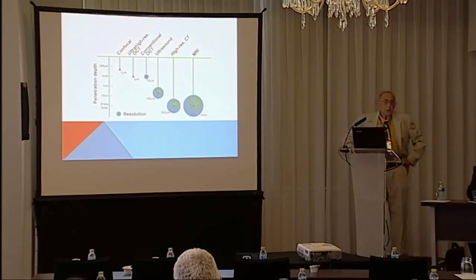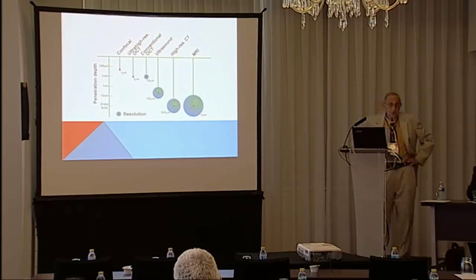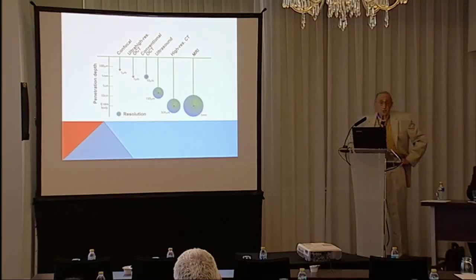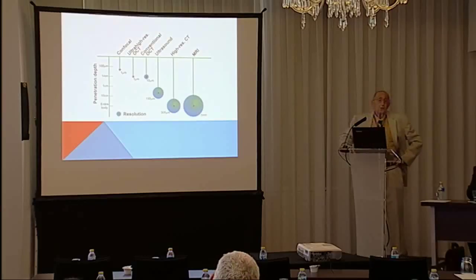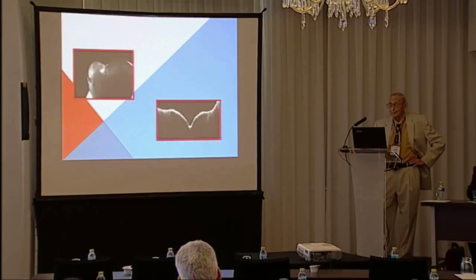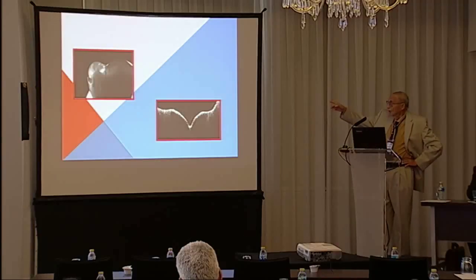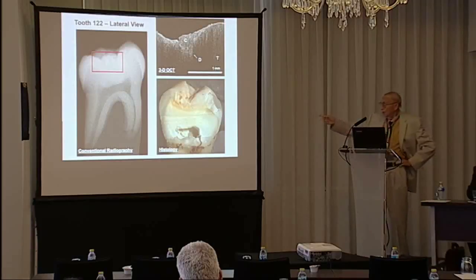Now, the penetration of the OCT. This is the one downfall of the OCT. You can only penetrate through the first 3 millimeters of tooth. You do not get the root surface. The only way you could probably get the root surface, if you need it, would be to take a digital pan. And this just shows the difference in the resolution. Here again, you've got your normal X-ray, your OCT. Same thing here with the histology.